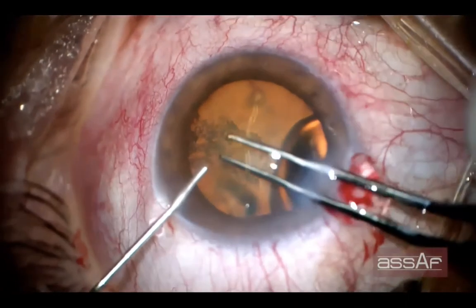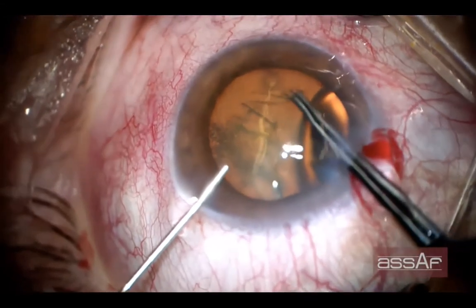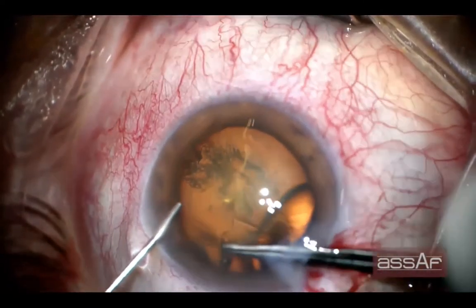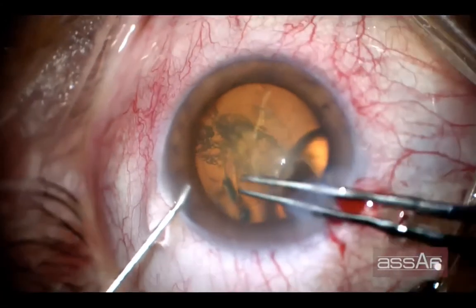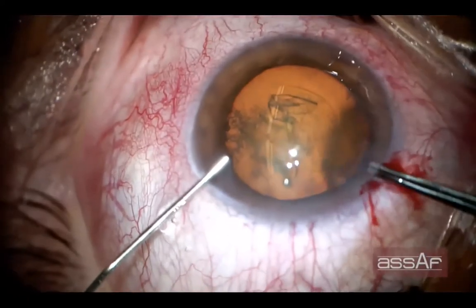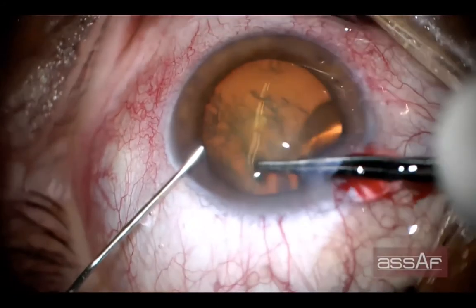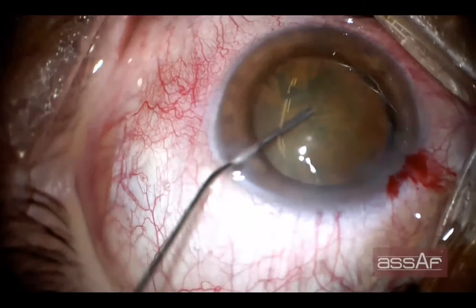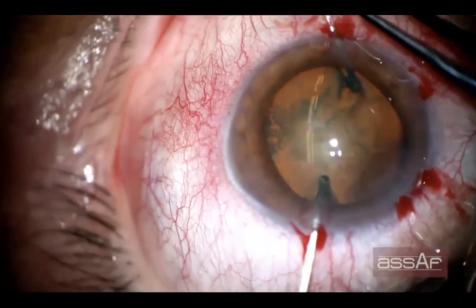So this is a case of mild lens subluxation that could not be detected during preoperative examination and can only be appreciated during rhexis formation intraoperatively. So be careful in this case. Sometimes during rhexis formation, the direction of the tear of the lens capsule may be abnormal because of the unequal tension on the anterior lens capsule by the areas of weak or absent zonule. So we have to rebuild the tension on the lens capsule every now and then by injection of dispersive OVDs while performing the rhexis. This is followed by hydrodissection and implantation of a capsular support system.